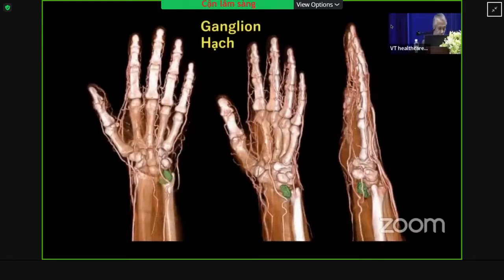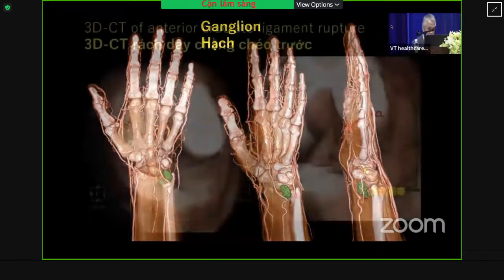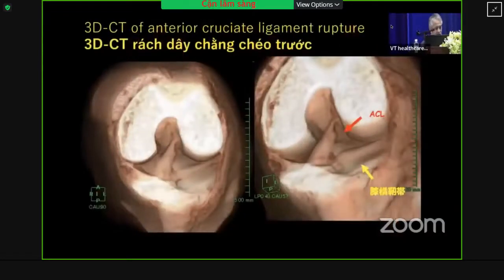Ganglion often recurs repeatedly, but can often be cured by suction treatment. But this case is a 3D image when it was actually removed by incision. MRI examination is mainstream for soft tissue, and it's currently impossible to replace it with 3D image. It becomes possible to grasp the rupture from the CT data with 3D image.